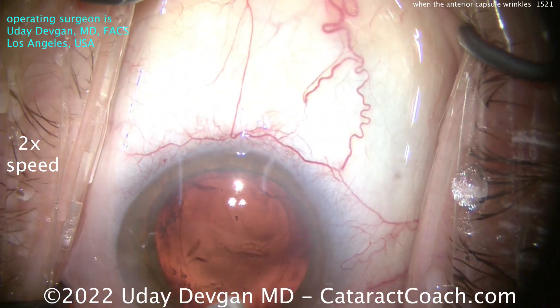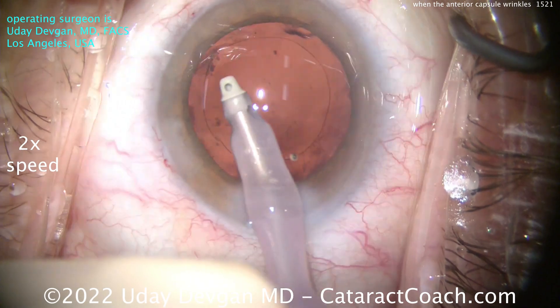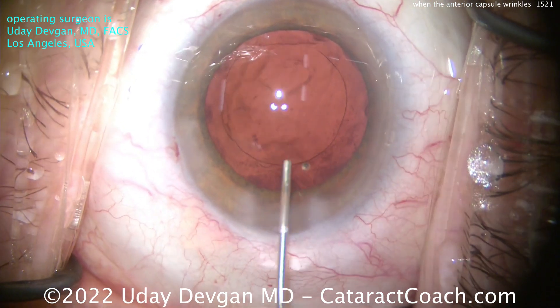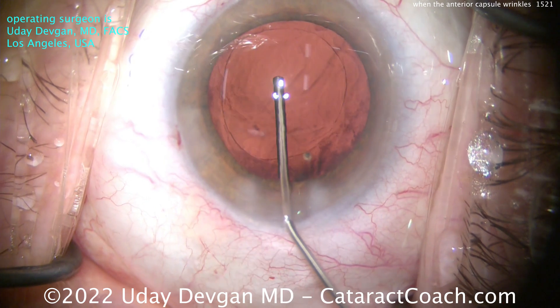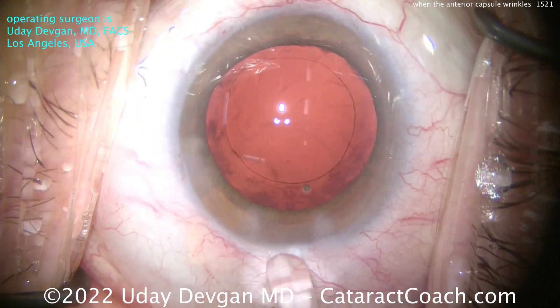Fortunately here, we don't have that issue. The capsular rhexis stays still — it does not move. Let's keep finishing up and polish the capsular bag. I don't want a lot of residual lens epithelial cells in the bag because that may predispose this eye to more capsular contraction later. Fill the bag with a cohesive viscoelastic. There's still a little bit of cortex and lens epithelial cells remaining — we'll clean those up at the end. Good-looking rhexis.